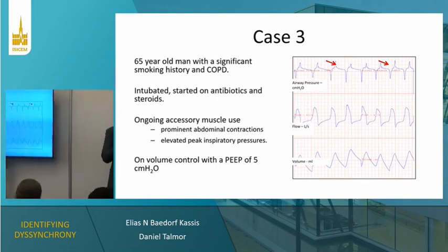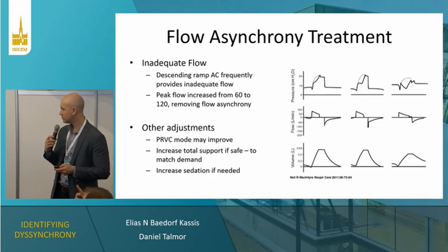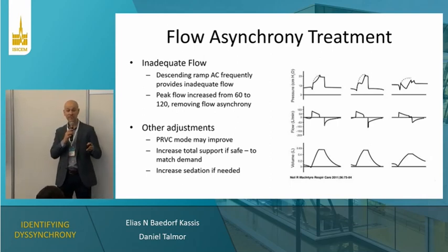Yeah. Please. Do you not get worried with the previous case about the transpulmonary pressure? Yes. So what we're not showing here is the esophageal pressures, and your point is very well taken, is that these are absolutely concerning. The total pressures that are being delivered potentially may be much higher than what we're actually seeing because of the diaphragm contraction.